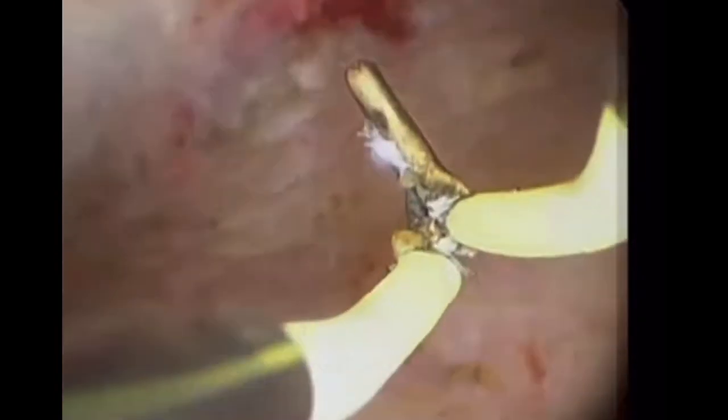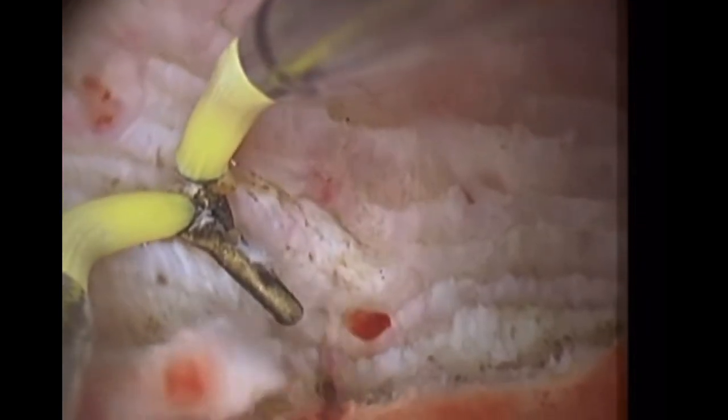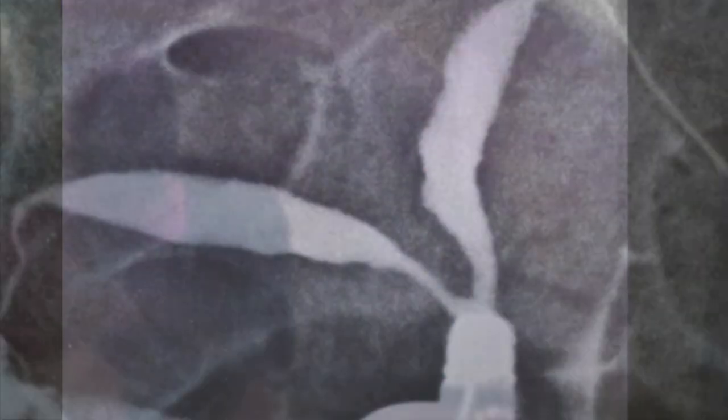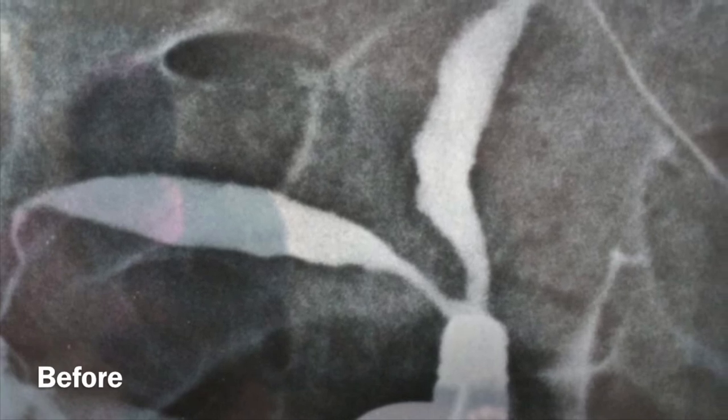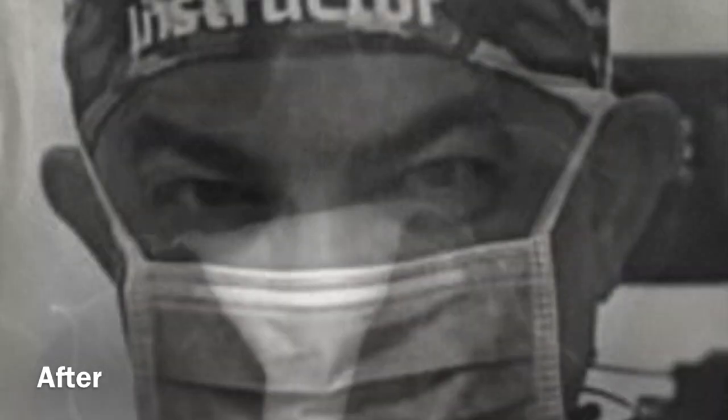Almost the reconstruction is completed. The final part near the fundus needs very fine adjustment and cutting. The cut-off limit of surgery is when both tubal ostia are at the same level, guided by the preoperative 3D scan which tells about the thickness of the fundus. Don't exceed the level of the two ostia, otherwise you'll perforate. Enjoy the final view and go out. This is a non-edited video showing the real time of surgery. I'm very glad to share the preoperative and postoperative hysterography with you. That's Osama Shawki from Egypt — thank you very much.